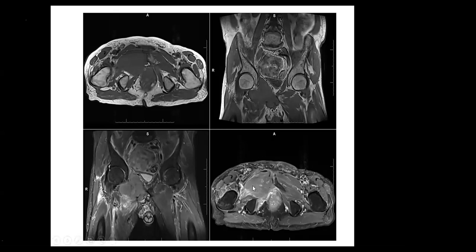In terms of the differential diagnosis, you said there is an associated large extraosseous mass. And I like that description, because it is the extraosseous mass that actually is going to narrow down your differential diagnosis. There's only two in an adult skeletally mature patient with a tumor arising from a flat bone, like the pelvis.